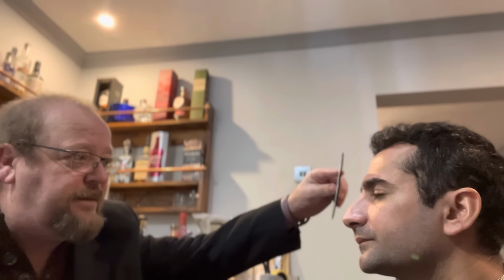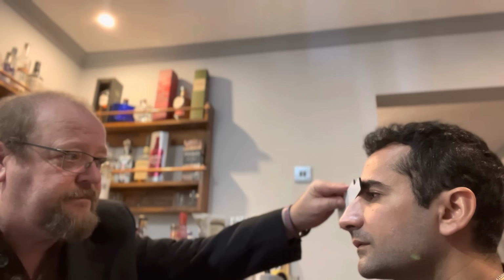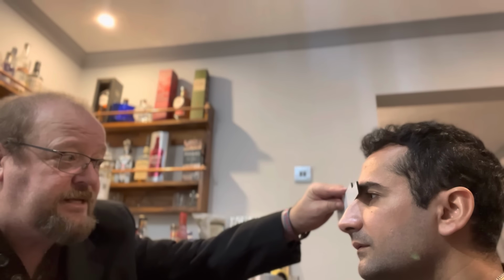And turn the ruler around, and I now measure it for the right. Again, I've tipped the ruler in about 10 degrees. Now this one I would say is 9, so it is slightly deeper. It's not unusual for the measurements to be different. In fact, it's more common to have them different than it is to have them all exactly the same.